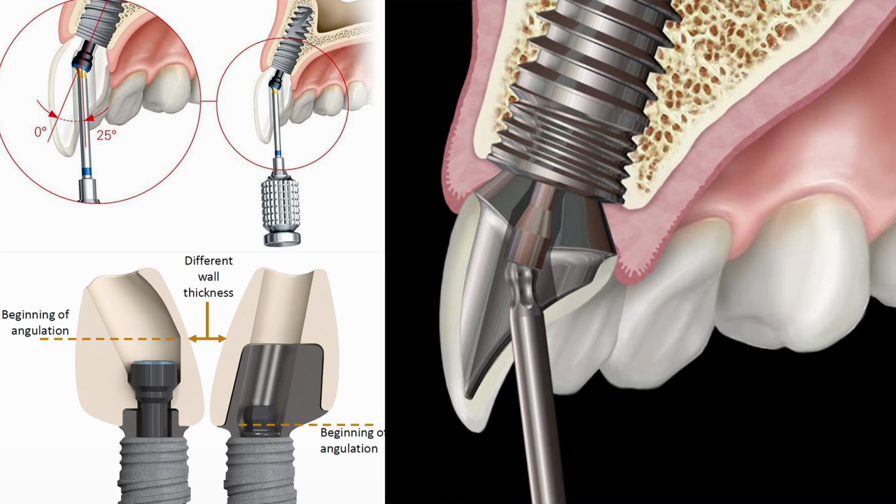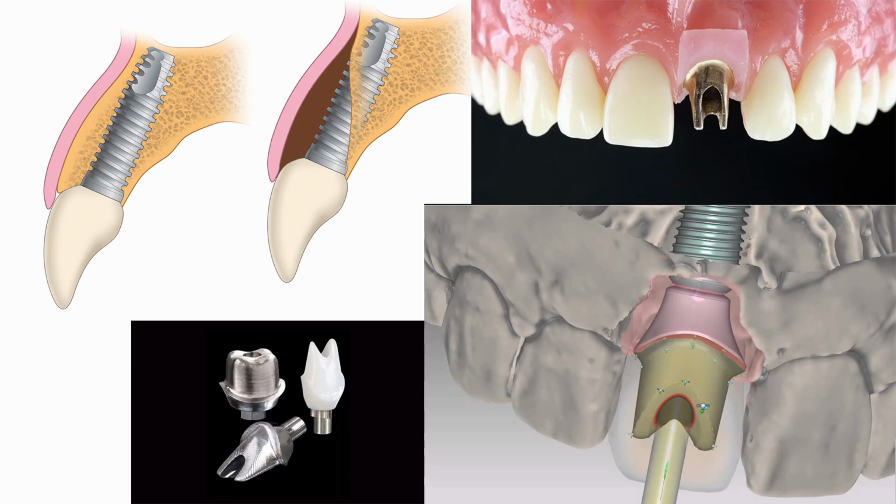However, due to inherent biomechanical limitations, performing AllonX treatment with cement-retained implant prostheses or using implant-assisted partial dentures is more advantageous for maintaining long-term treatment outcomes. To eliminate connection errors between implant components and fabricate abutments for AllonX or implant-assisted partial dentures using the direct impression technique, the abutment implant connection design is crucial. That is, fixtures should be placed according to the anatomical form of the residual bone, abutments should be connected accordingly, and cement-retained implant prosthetic treatment should be performed.